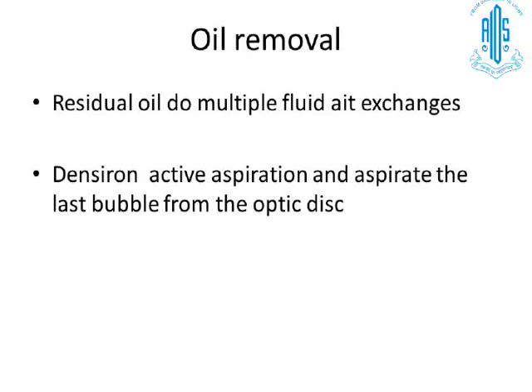Again, when you are doing oil removal, you may leave some oil behind, and in order to see to it, you need to do multiple oil air fluid exchanges. Go into the eye, see that in the periphery there is no emulsified oil which is adherent to the retina, and you have to remove all that.